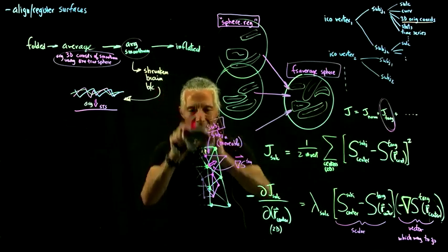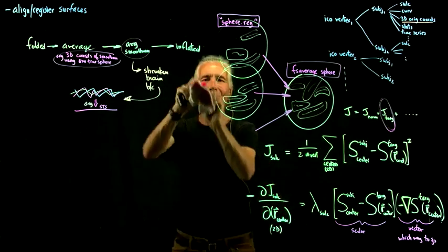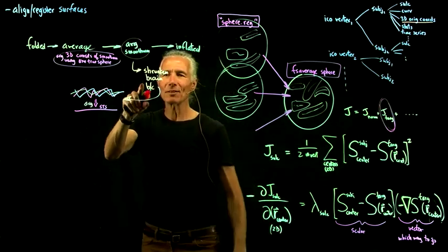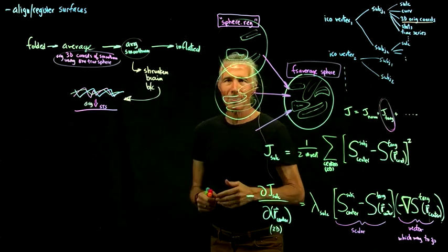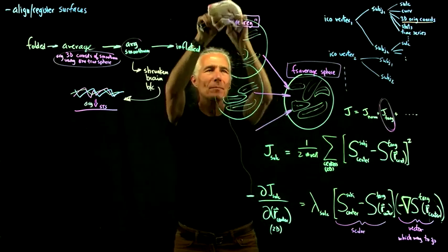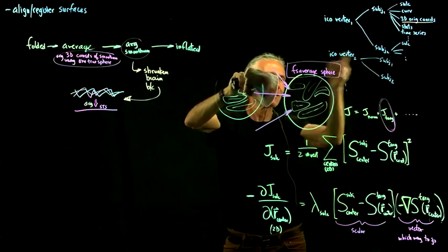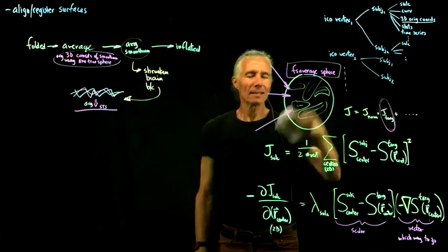So what's the right way to do it? Well, it was sitting there for years. Nobody really used it. Now you might wonder, why would anybody use the shrunken brain? One of the reasons is that sometimes people don't want to mess with doing statistics on the sphere, in this list of vertices.